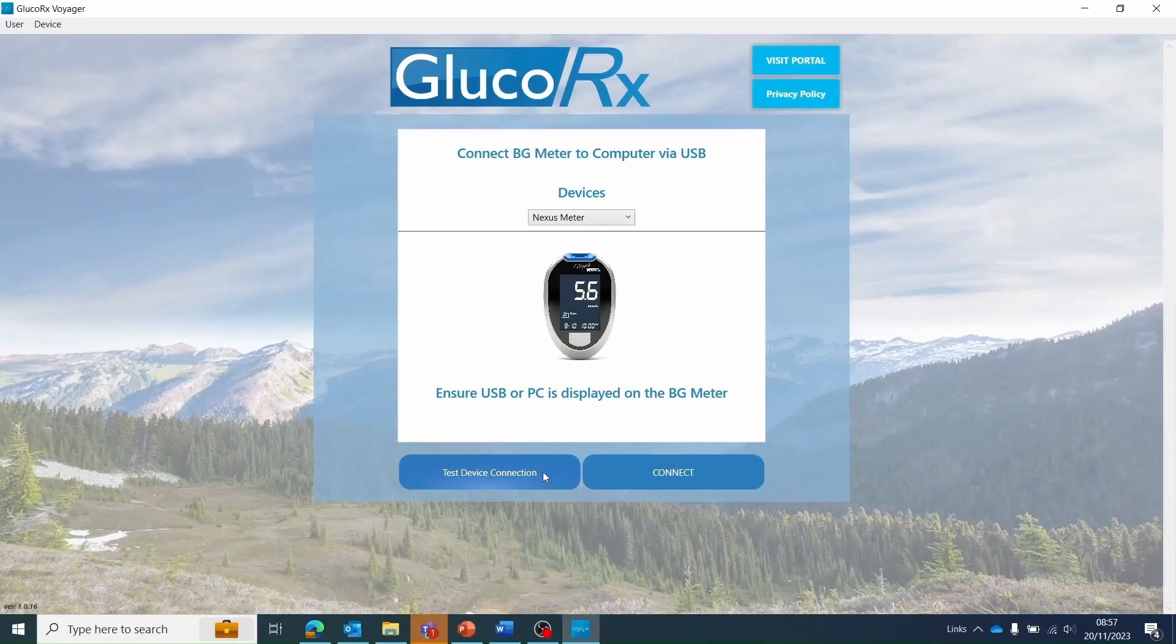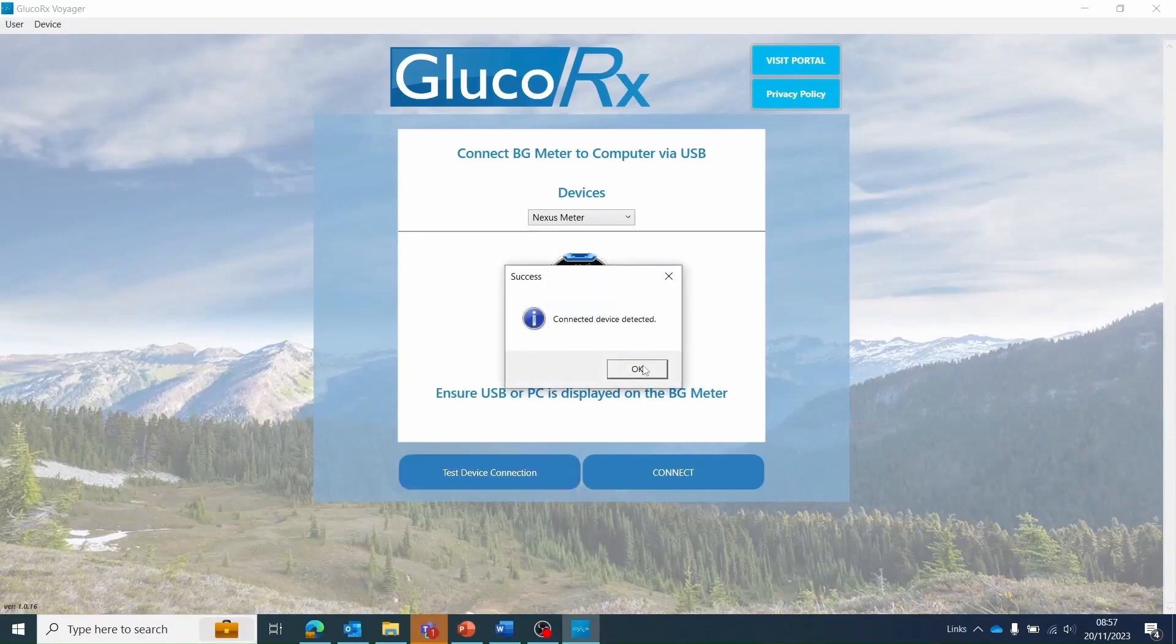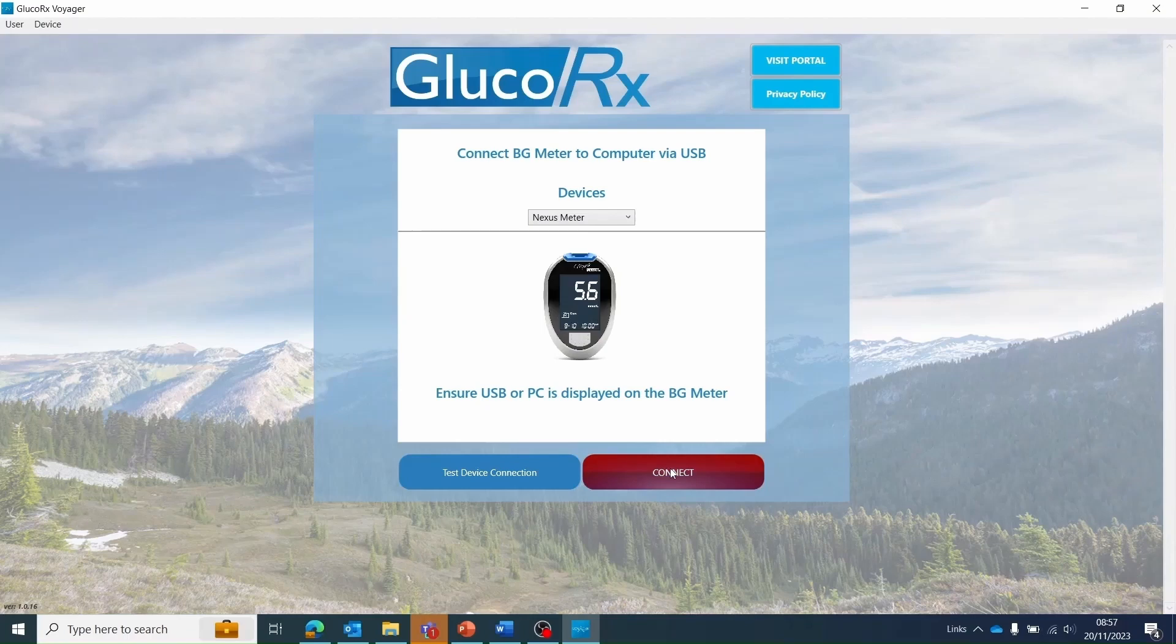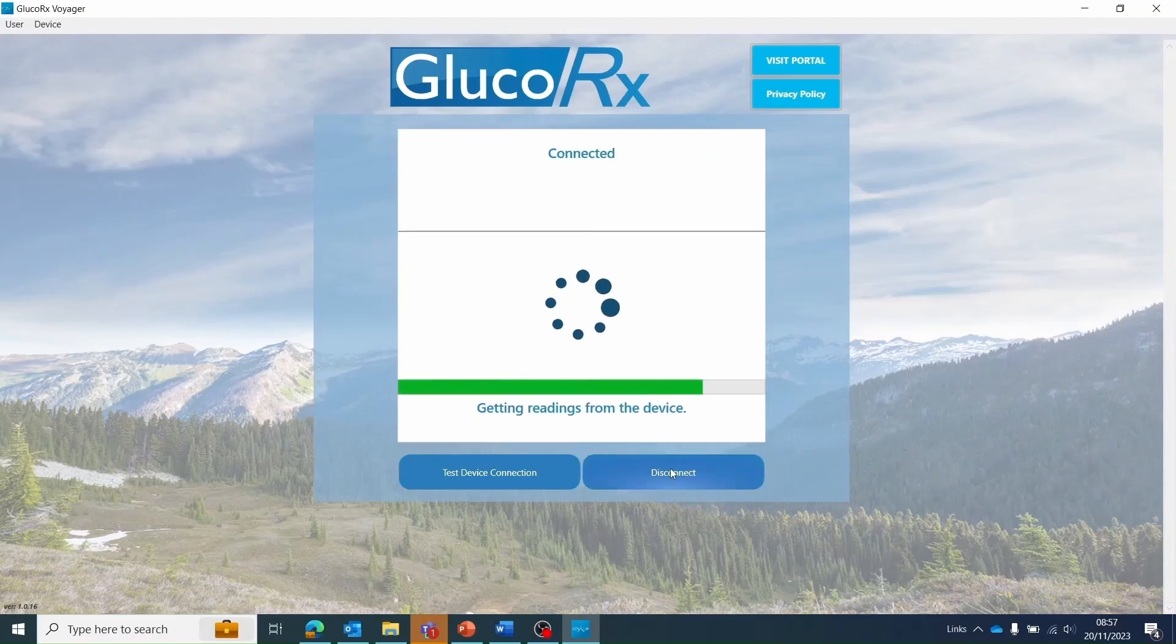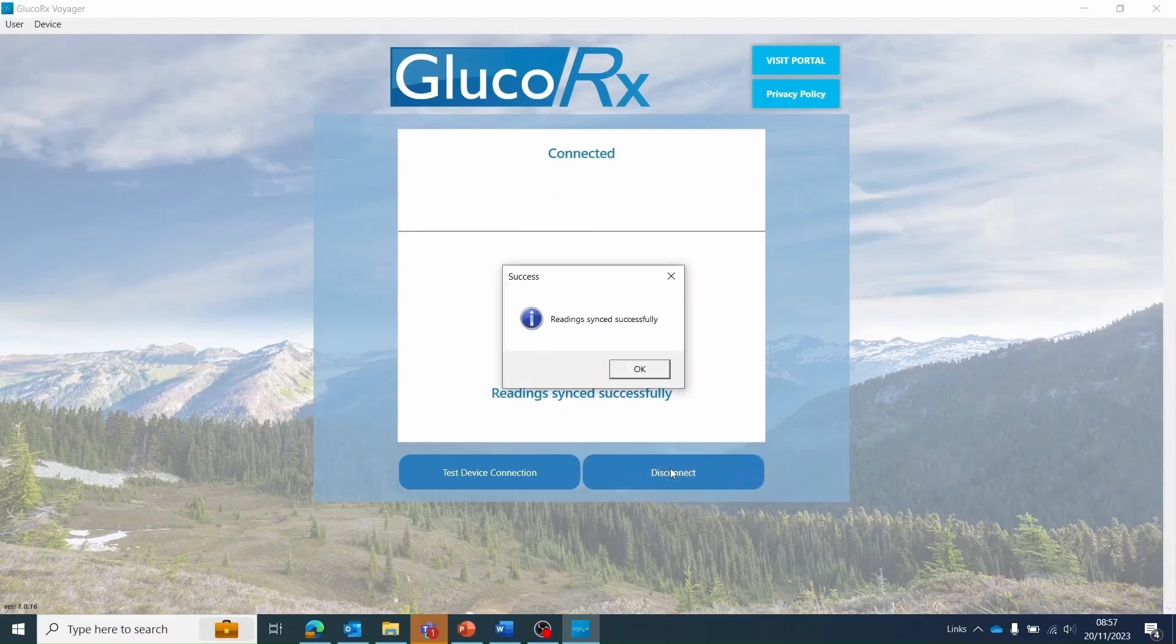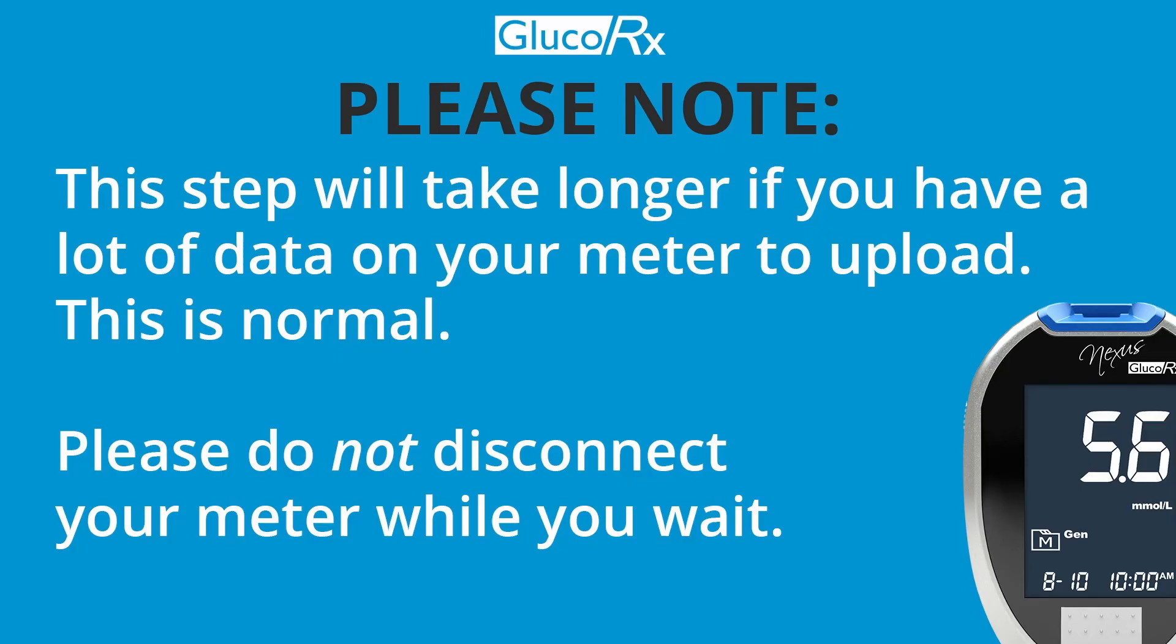You can test your connection by clicking the test device connection. This will let you know that everything is connected properly and ready to use. Select the connect button to begin uploading your readings to the Voyager software.